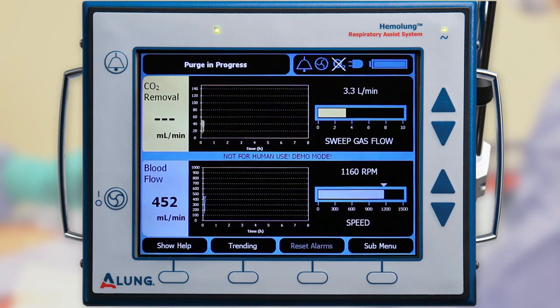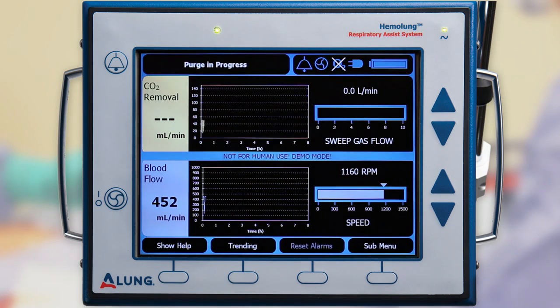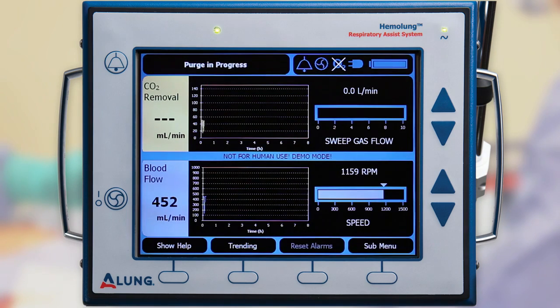During therapy, the controller automatically enters a purge cycle every 15 minutes. This creates a vacuum in the sweep gas circuit to remove any moisture. During the cycle, the on-screen CO2 removal will be temporarily paused.